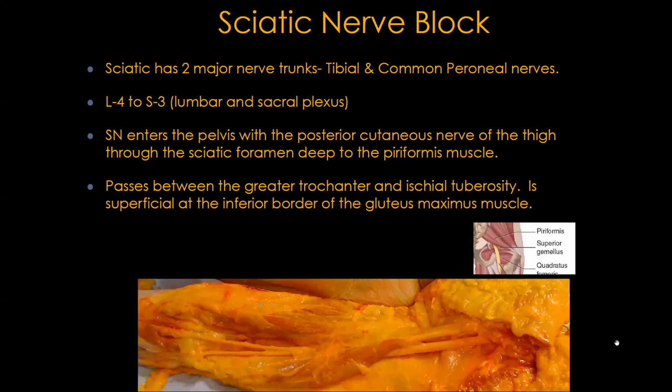And the other thing is to scan up and down pretty fast, because if you are in one spot, your brain just sees tissue. But if you scan up and down, you see this continuous structure. I remember struggling with the popliteal, trying to find the nerve, but now it pops right out at me. And a lot of it has to do with pushing hard, changing the angle, moving up and down, finding it.